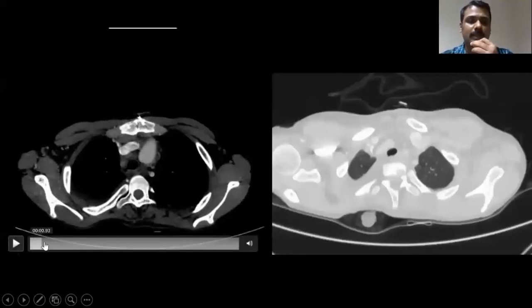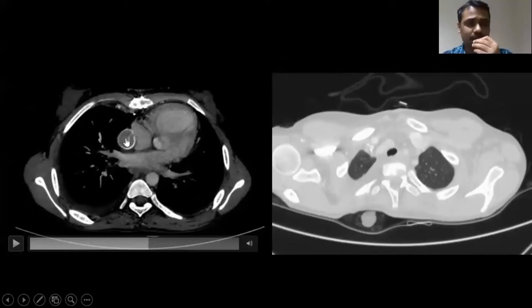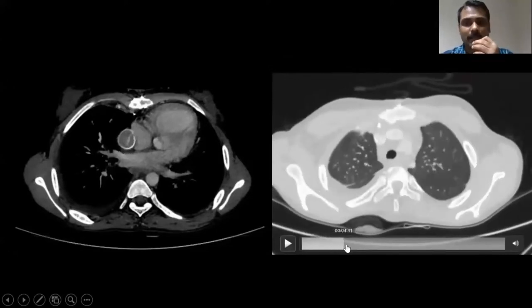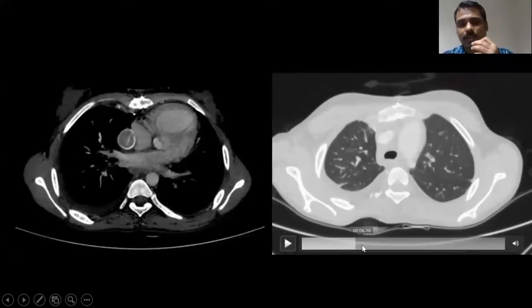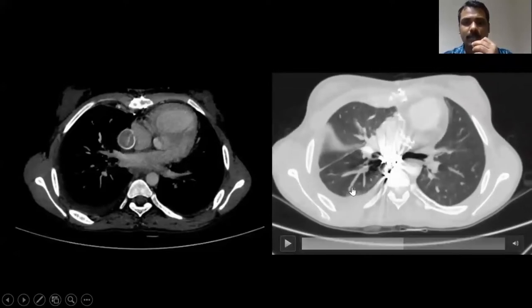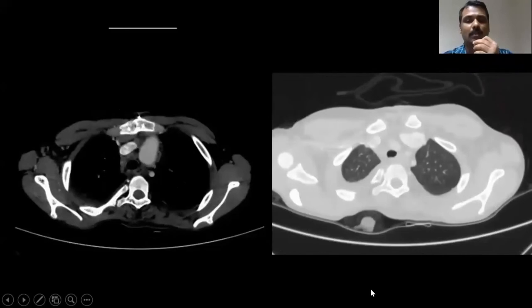Since the patient presented with hemoptysis, this is the aortic phase angio, and we couldn't identify any aortopulmonary collaterals. In the earlier opacification phase, the Fontan circuit shows some artifacts which shouldn't be confused with thrombosis. Pulmonary parenchymal imaging in lung window shows some fissure effusion, ground-glass opacity in the posterior segments, and nearby pulmonary artery and venous branches, suggesting a pulmonary AVM-related bleed as the cause of hemoptysis.